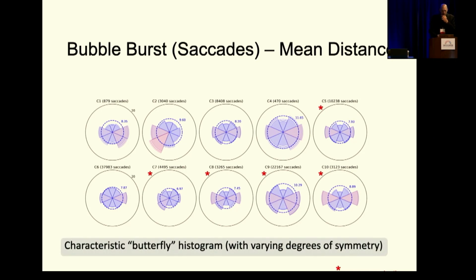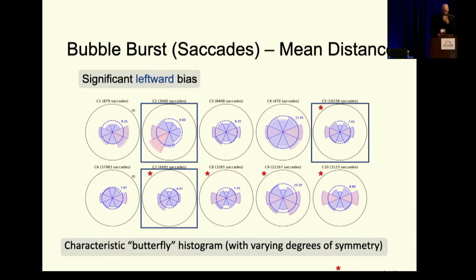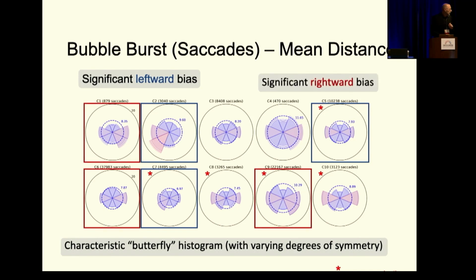That's very evident here when you look at, say, the biases. So if you have saccades, you can see that there is a bias in the leftward direction. Because many brain injuries occur in a lateralized way, you often have asymmetries. This allows us to not only say there's an asymmetry, but quantify how much that asymmetry is, and you can have the opposite and so forth.